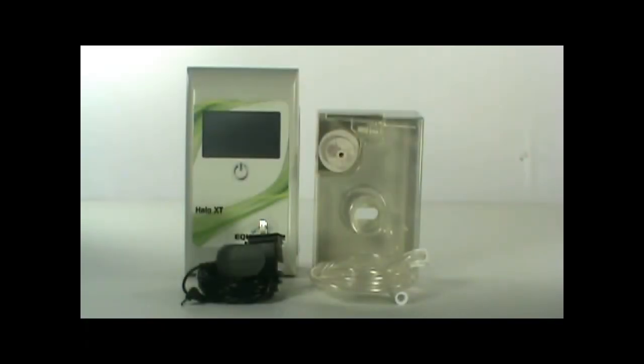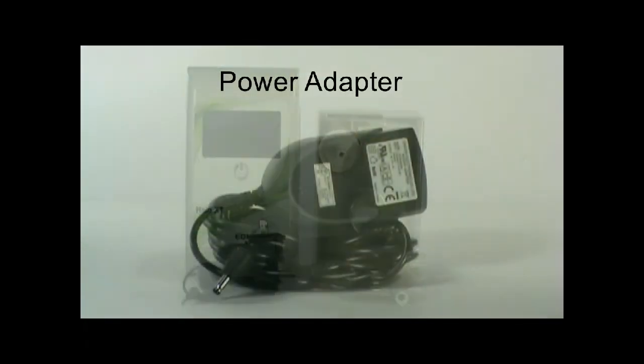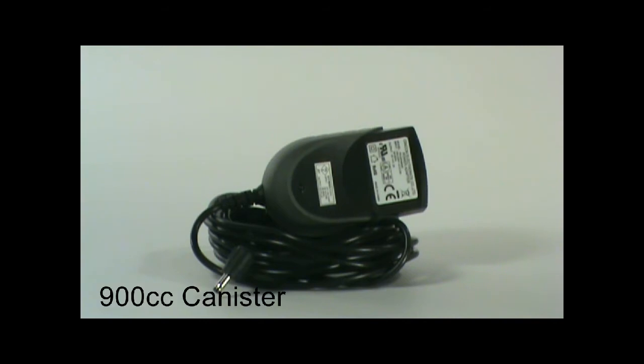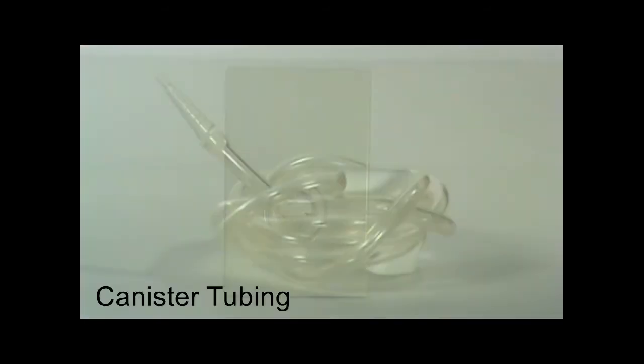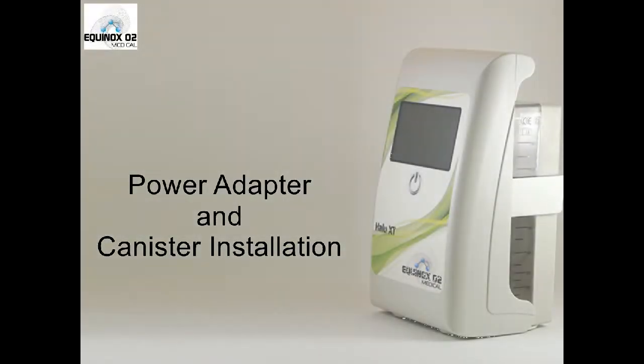Halo XT NPWT pump comes with the following: power AC adapter, 900cc canister, and your canister tubing. Power adapter and canister installation.